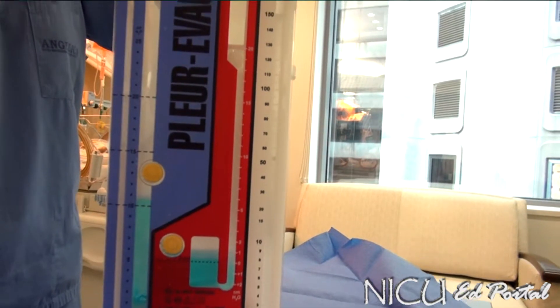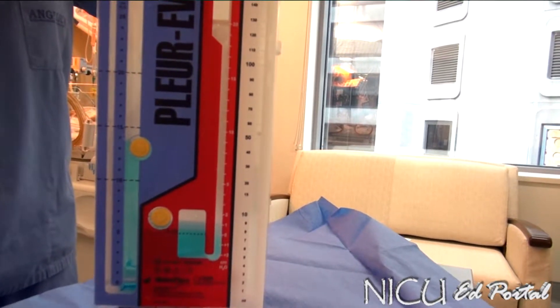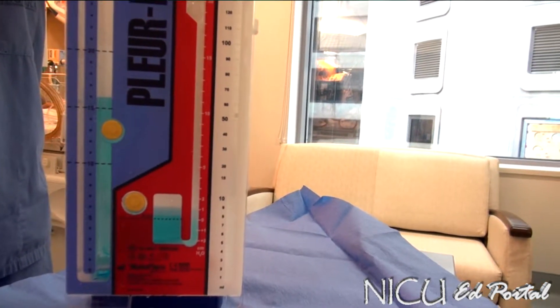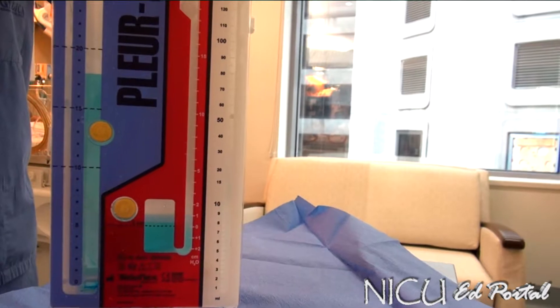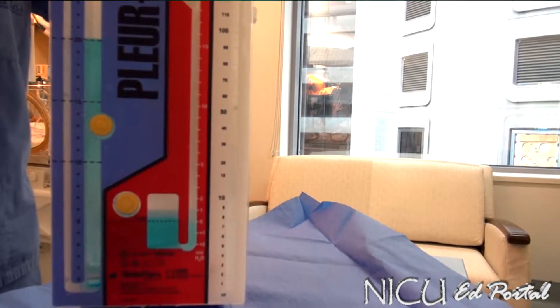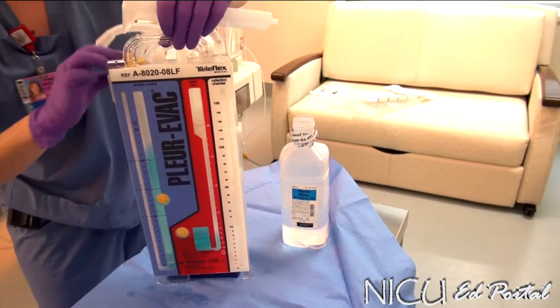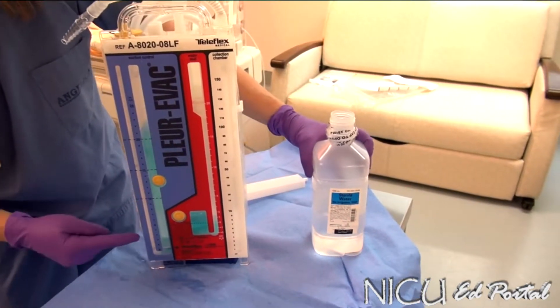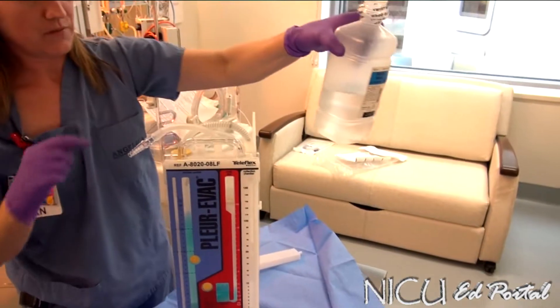Make sure you close your atmospheric vent cap tightly. Just to benchmark how much water we've actually put in: even though that is up to 20 cm of water suction and 2 cm for the water seal chamber, we've used close to 500 mL. So make sure you get a full container of sterile water.